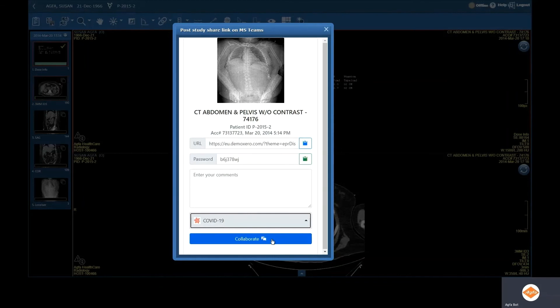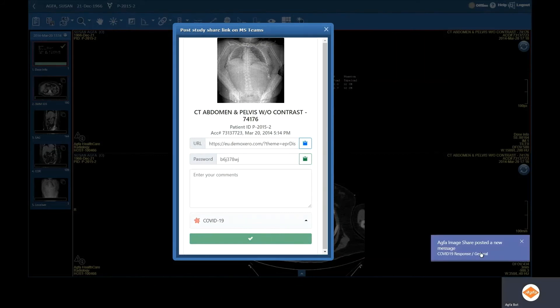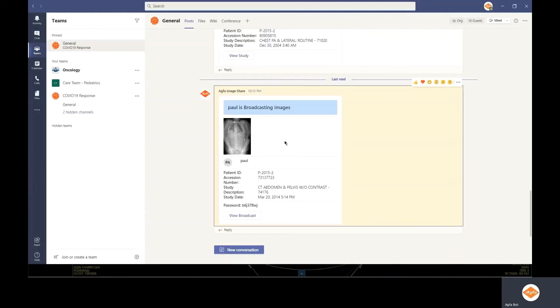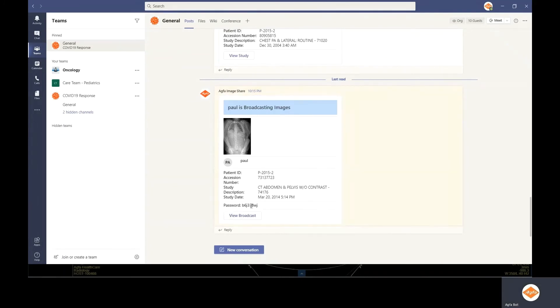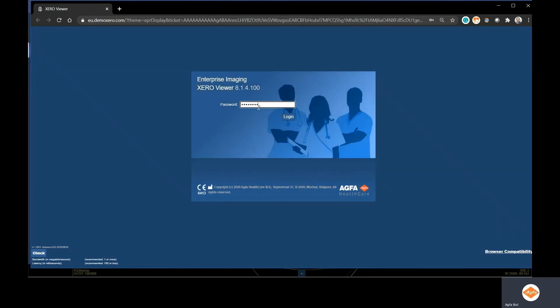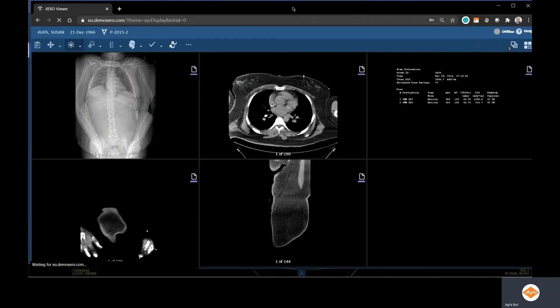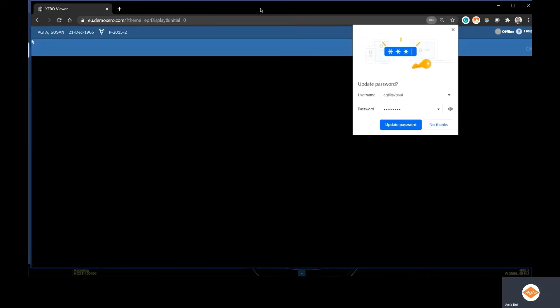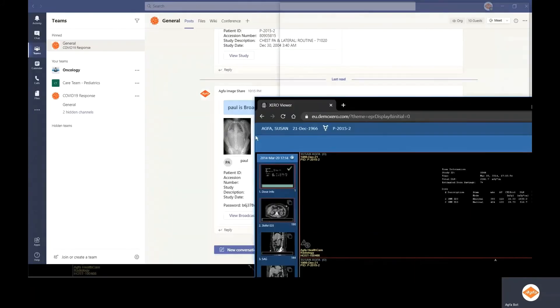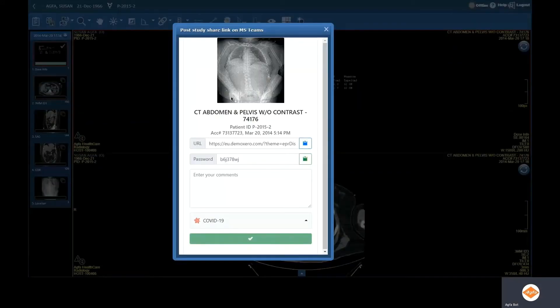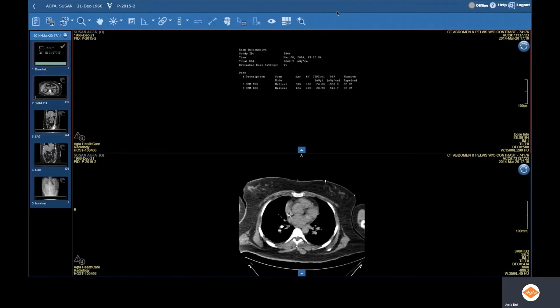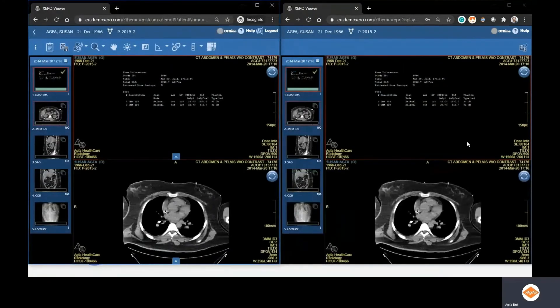In this case, we're going to send a collaborative message to the COVID-19 channel. In the COVID-19 channel, there will be a notification to users in that private channel that Paul is now broadcasting images. The user can copy the password and then simply view the broadcast. We'll paste the password in for secure access to the broadcast of medical images using Agfa Healthcare's high-quality streaming technology.